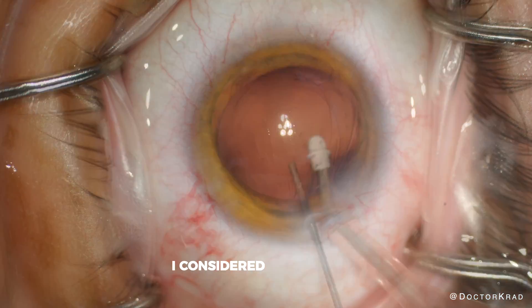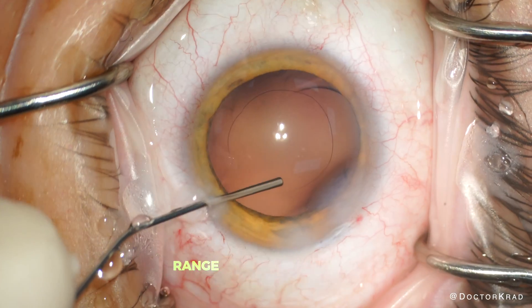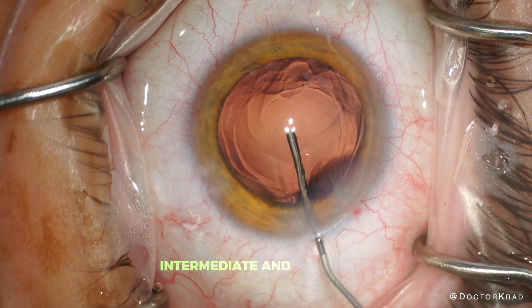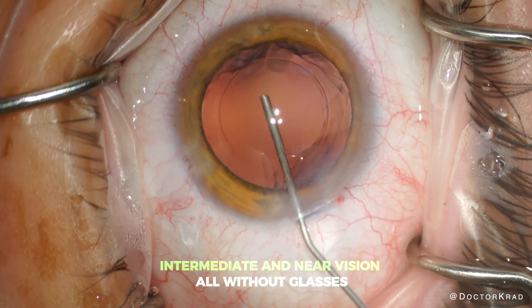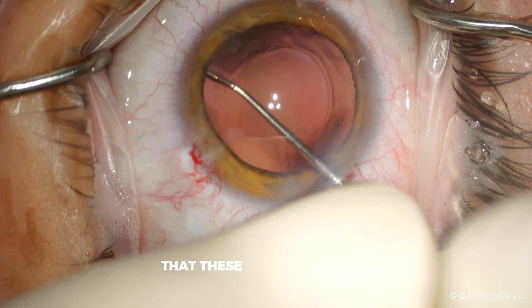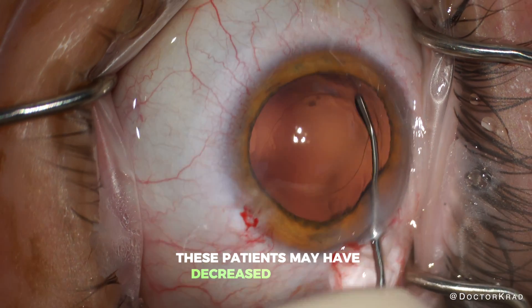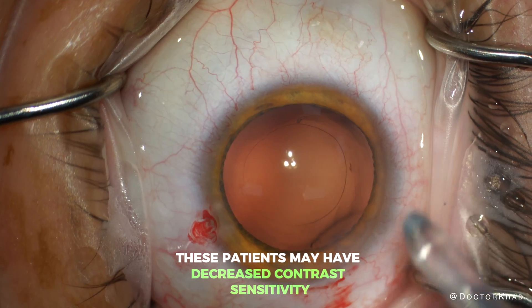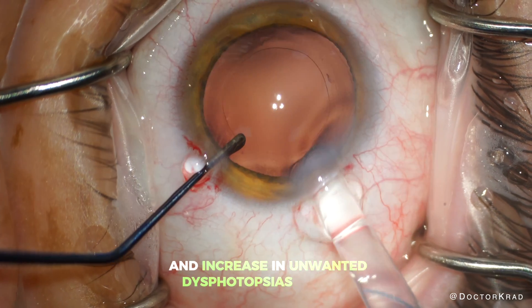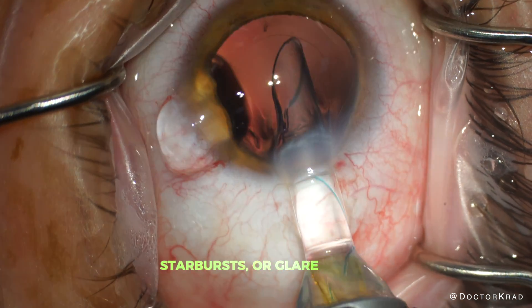I considered a multifocal lens for this patient since multifocal lenses provide the maximum range of vision, allowing patients to see far, intermediate, and near vision all without glasses. But they do so at the expense of overall quality of vision that these healthy eyes are used to. Specifically, these patients may have decreased contrast sensitivity, decreased vision performance in low light, and an increase in unwanted dysphotopsias at night — which are halos, starbursts, and glare around lights at night.